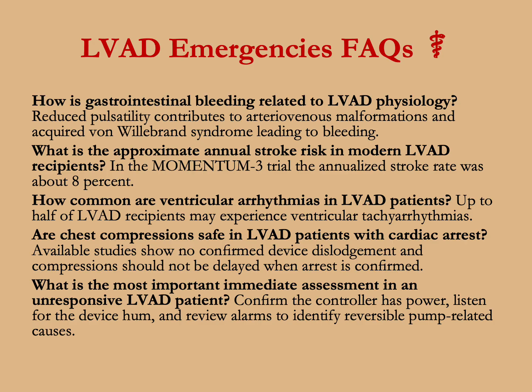What's the approximate annual stroke risk in modern LVAD recipients? In the MOMENTUM 3 trial, the annualized stroke rate was about 8%. How common are ventricular arrhythmias in LVAD patients? Up to half of the LVAD recipients may experience ventricular arrhythmias. Are chest compressions safe in LVAD patients with cardiac arrest? Available studies show no confirmed device dislodgement, and compressions should not be delayed when arrest is confirmed.